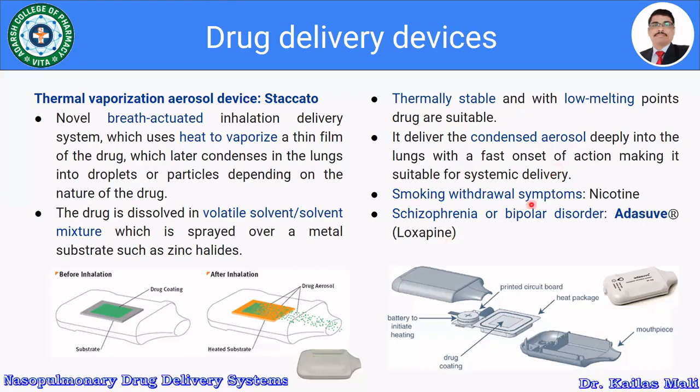It is used for smoking withdrawal symptoms, to deliver nicotine, and in the case of schizophrenia or bipolar disorder, it is used to deliver loxapine. The device which is available is Adasuve. This is the Adasuve device, which comprises a battery to initiate the heating. This is the plate on which the drug is loaded. There is a heat package, and this is the mouthpiece. So this is about the thermal vaporization aerosol devices, Staccato and Adasuve.